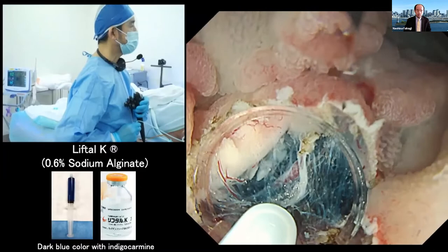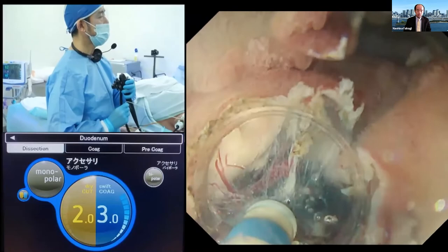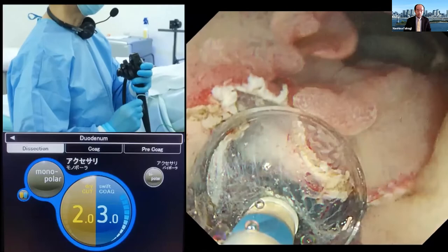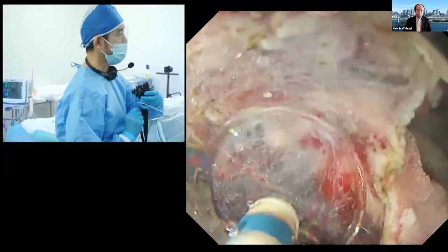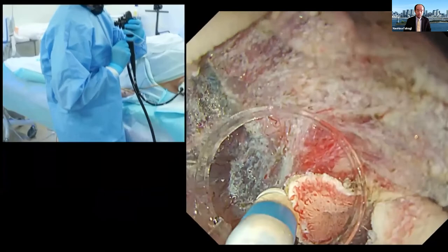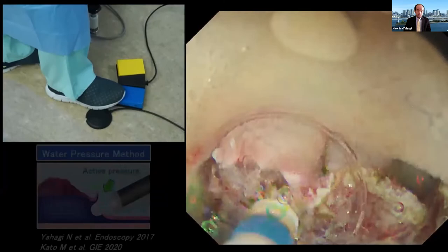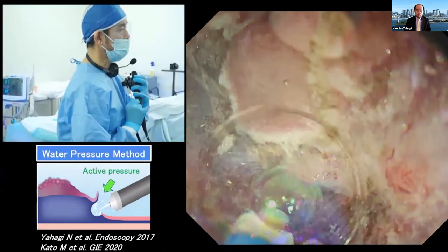Carefully catching the submucosal layer and controlling my wrist to the right side. Maneuverability of the endoscope is very poor, but I carefully catch the target tissue and gently control the wrist. This is the right side edge — by hooking here and moving toward the safe side. This is the left side edge. By hooking the edge of the remaining tissue, I can widely open the submucosal space. This is almost the end of the resection. Now we can see the folder here.